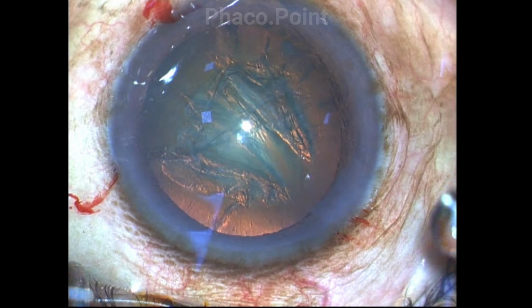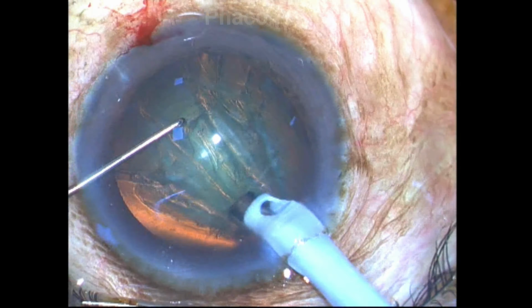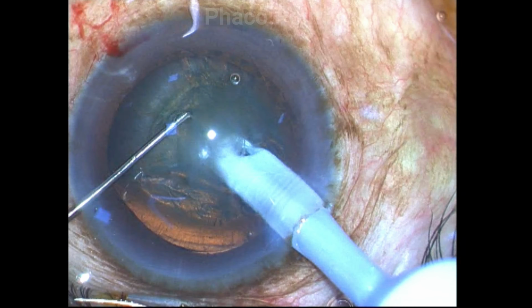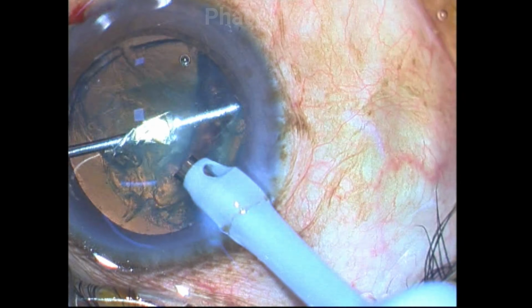Now let's get to the surgery itself. This is a case of a grade 2 nucleus sclerosis and we are about to perform a direct chop. Having turned the bevel down, the surgeon now impales into the nucleus, into its middle, goes all the way down and with the second instrument creates the chop, which results in the fracture of the nucleus into 2 heminuclei.